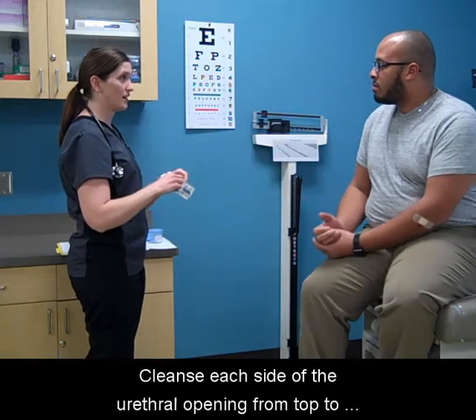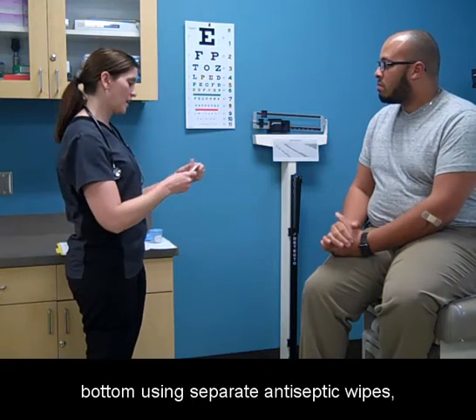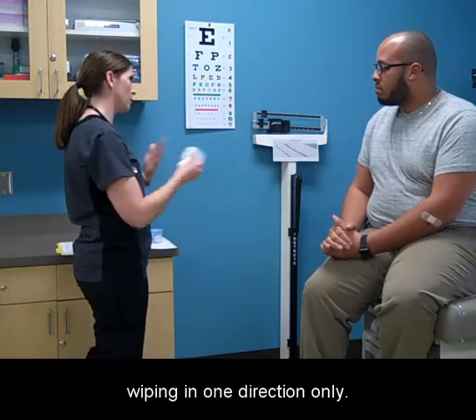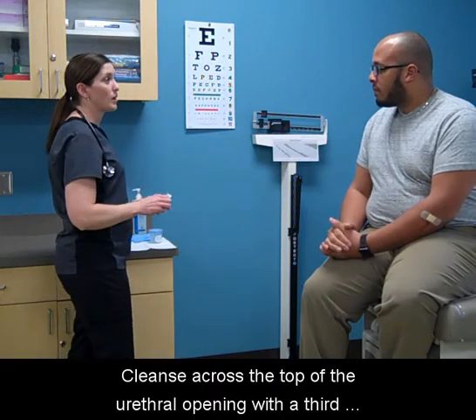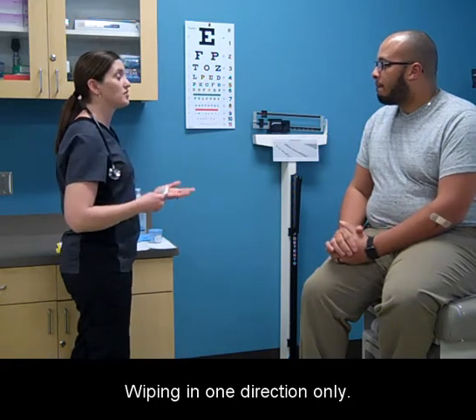Cleanse each side of the urethral opening from top to bottom using separate antiseptic wipes, wiping in one direction only. Cleanse across the top of the urethral opening with a third antiseptic wipe, wiping in one direction only.